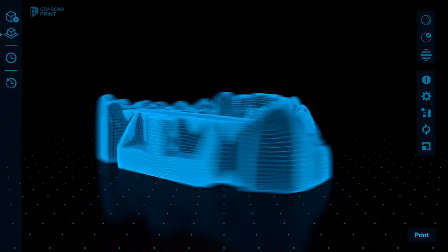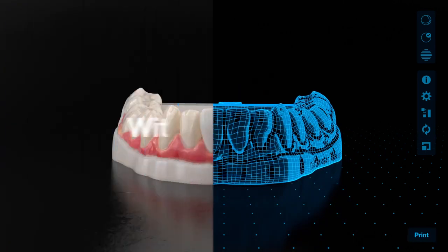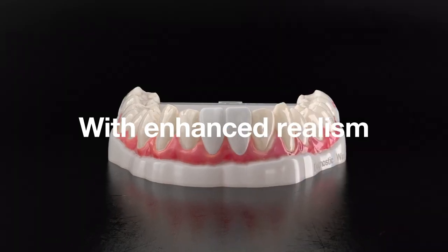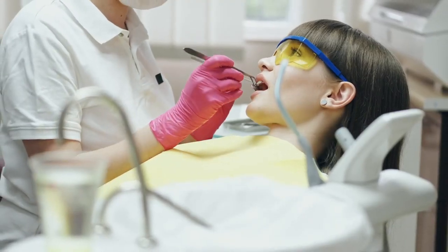Deliver patient-specific, full color case presentations, with realism previously only possible with time-consuming wax models, and better your communication with clinics.